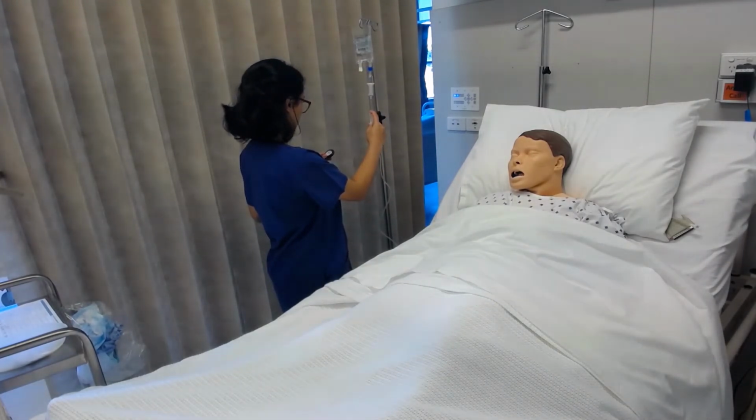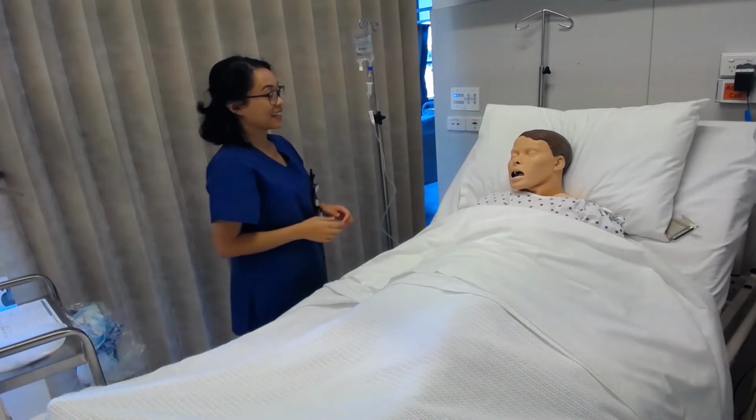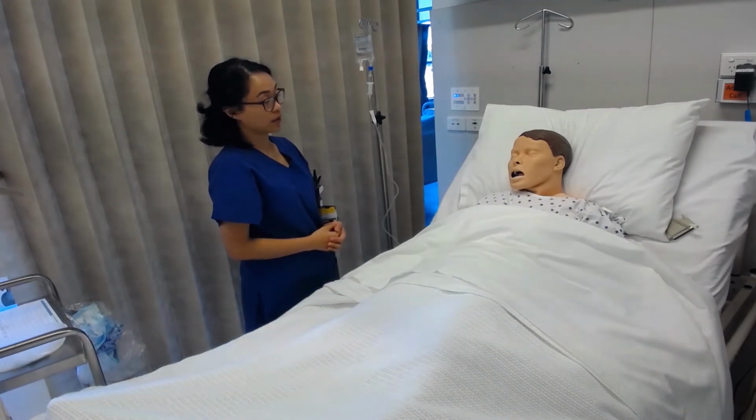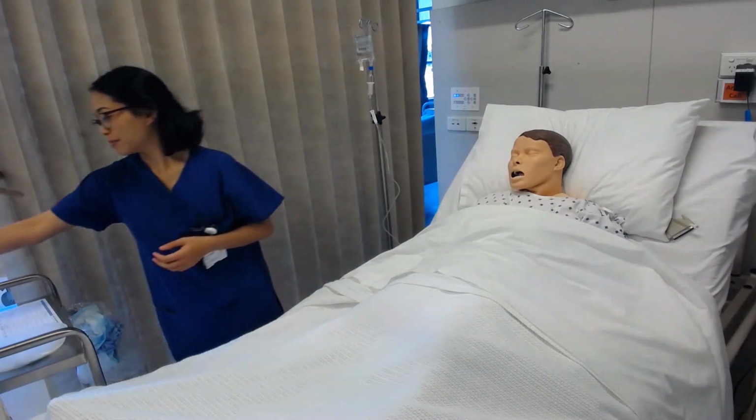Conclude your interaction with the patient, leaving them calm, informed, and reassured. Perform hand hygiene, dispose of all your rubbish, dispose of your sharps into the sharps bin, and perform accurate documentation in both the medication chart and the fluid balance chart.